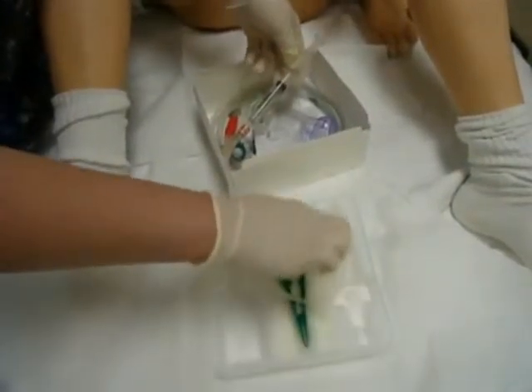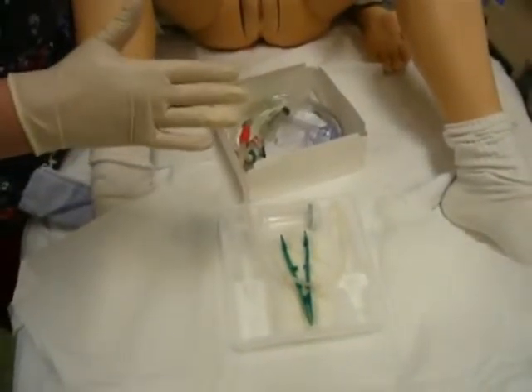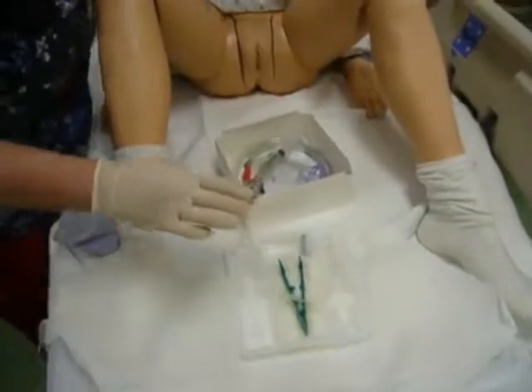If you have a different catheter brand — we do not — so we do not do that step; we just connect it there and let it lie. Now before I move to contaminating my left hand, I need to make sure that my cotton balls are ready right here, my lube is ready, and my catheter is ready.